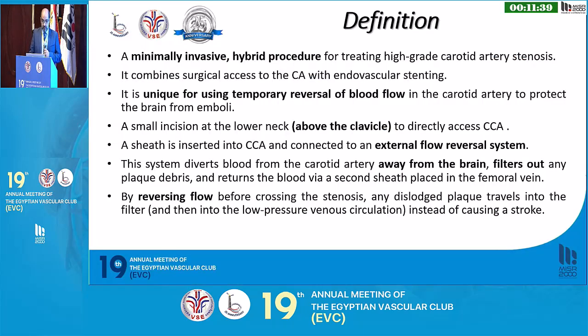The TCAR is a minimally invasive hybrid procedure for treating high-grade carotid stenosis, and it combines both surgical access and endovascular stenting. It is unique in using temporary reversal of blood flow in the carotid artery to protect the brain from emboli. A small incision just above the clavicle allows direct access to the common carotid artery. The sheath inserted into the common carotid artery has an external flow reversal system, and this system delivers the blood from the carotid artery away from the brain, filters it from all the debris, and returns the blood again to the femoral vein.